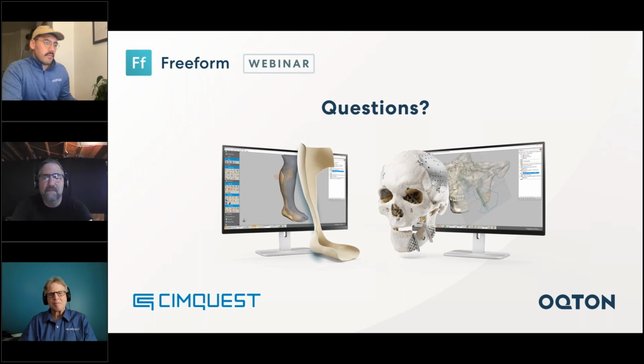It is a cleared medical product, for example. It does have a 510K and CE mark around it, but it's a very comprehensive segmentation tool set aimed at medical grade DICOM. Works very nicely with Freeform. It's got an automatic export import into Freeform as well. But if anyone wants more information or demonstration, don't hesitate to reach out and we'll just get that arranged with no problem.